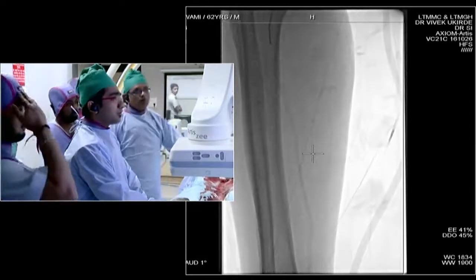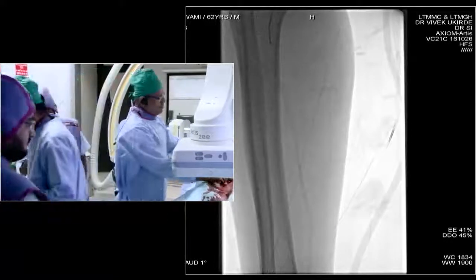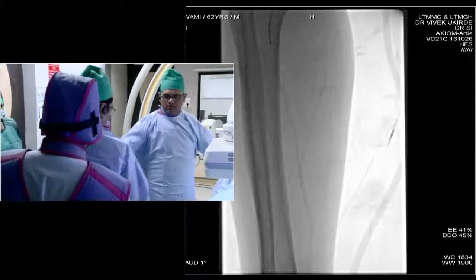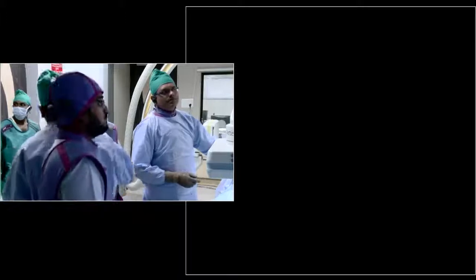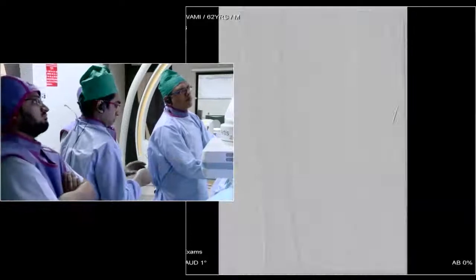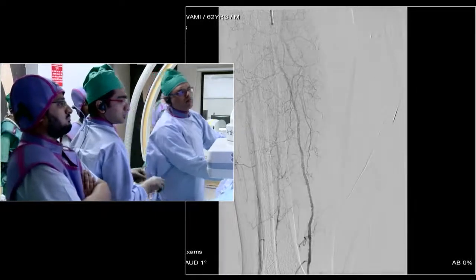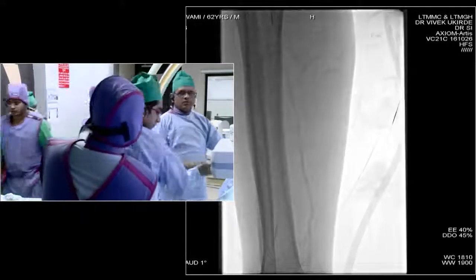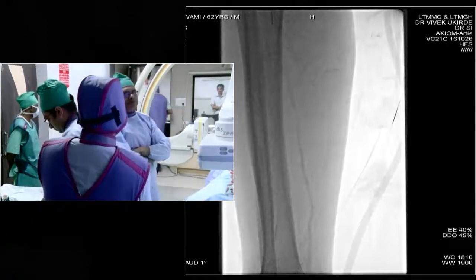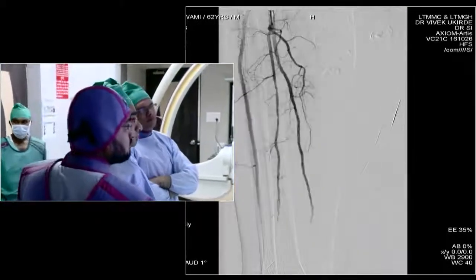I'm taking the wire out now and taking a run to demonstrate. Note that if you wanted to keep the wire inside, you could have used a Y-connector. How is the creatinine of this patient? It's very important in all these diabetic foot patients to evaluate creatinine levels. This shows extensive atherosclerotic disease with calcified plaque along the full length of the vessel.